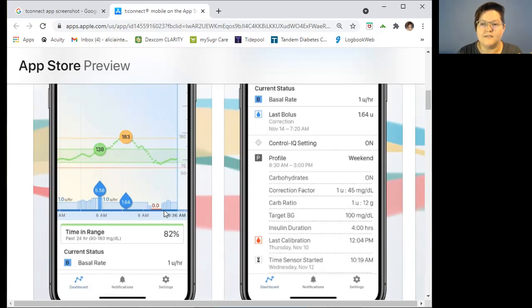Or if I'm over here, say I'm going to eat at maybe 9:15, it looks like right about here. Well, my carb ratios work really well, but they're predicated on a full basal complement. If my full basal is being delivered, my carb ratio gets me from A to B really nicely. Basal insulin acts like gravity. If I've got full earth gravity and I jump, I'm going to have a predictable trajectory and landing.